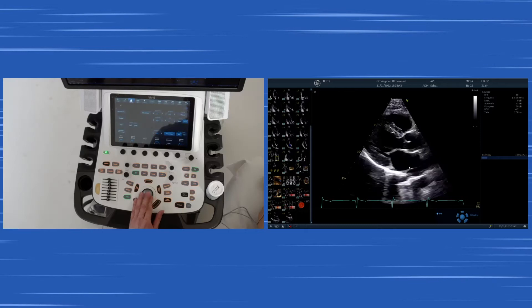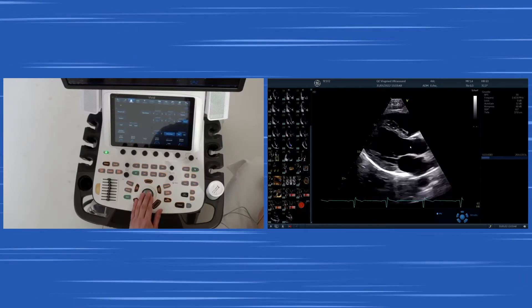That's the left atrium, the left ventricle, here the aortic valve in the center of the image.